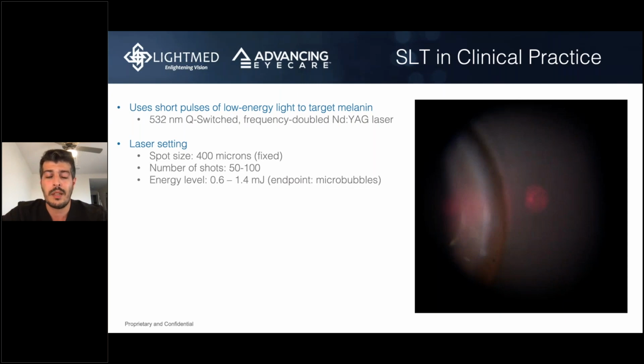If the pressure is truly that all the time, you're probably looking at surgery. So for that specific example, I would figure out why the pressure is 50. Pressure of 50 is not normal, might be a glaucoma attack, but that's not a patient you're thinking SLT for. But when we talk about high eye pressure in the open angle glaucoma world, we're talking about mid-20s, sometimes 30s. Yes, you can by all means start with SLT, and if you get to your IOP goal, great. If not, you can either repeat it or go to eye drops. But think of all these options as tools that they're going to get to pressure that you want to get to.